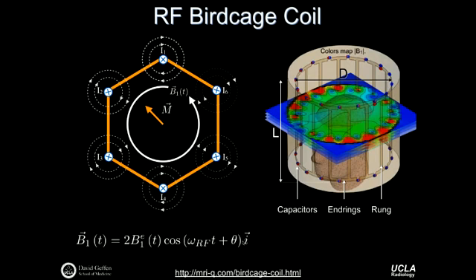A question? So is current flowing through each rung at a different time, right? Yeah, every rung has a sinusoidal current running through it. So the amplitudes of the currents are just out of phase with one another. And the frequency is of the current flowing through each rung.